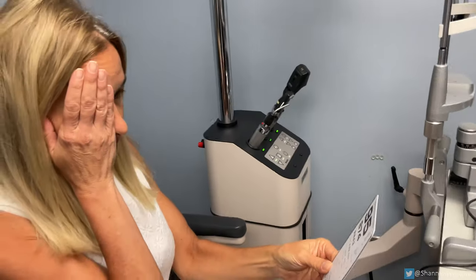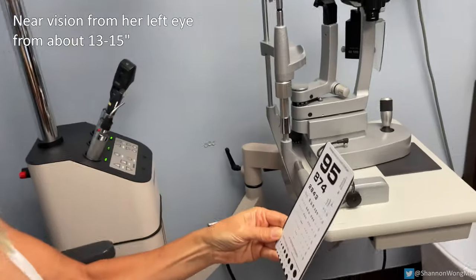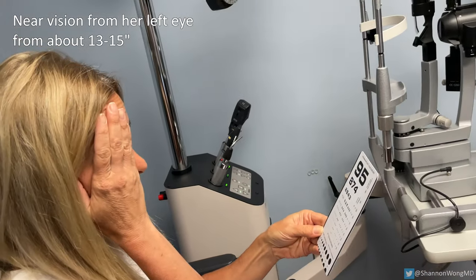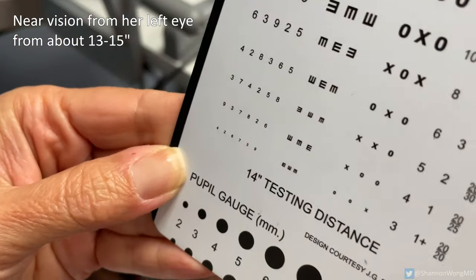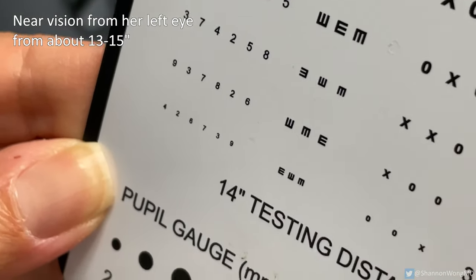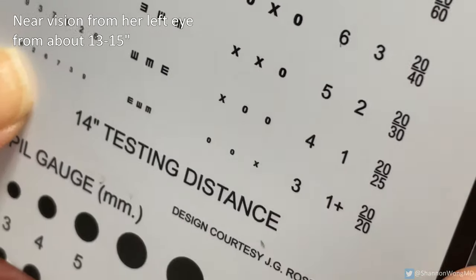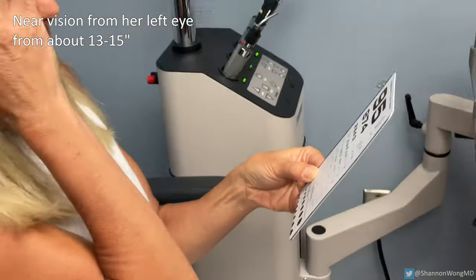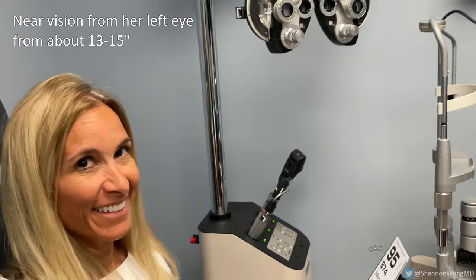Now covering her right eye, she uses the Synergy lens in her left eye. Holding the card at roughly the same distance and adjusting to whatever gives the best clarity, she reads from the bottom up: '4267,' '39,' and then '93782 6.' That's the 20/20 line and below. At about 16 inches, her near vision with the Synergy lens is excellent.